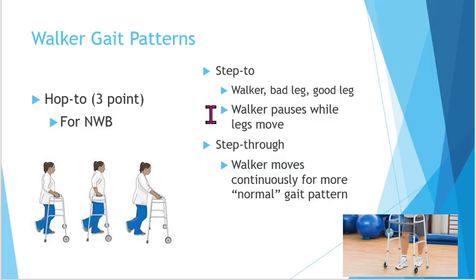In a step-to pattern, the walker pauses while the person moves their legs. So it is very much like a repetitive motion. It's walker, bad leg, good leg, walker, bad leg, good leg. Versus somebody who is less painful, or maybe they're using it for more of a balance problem than an injury or surgery problem.